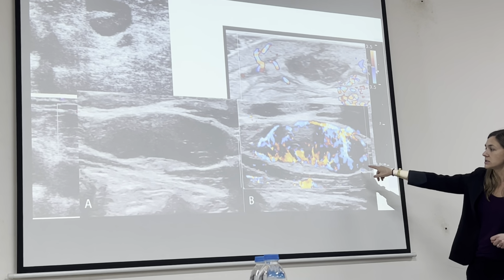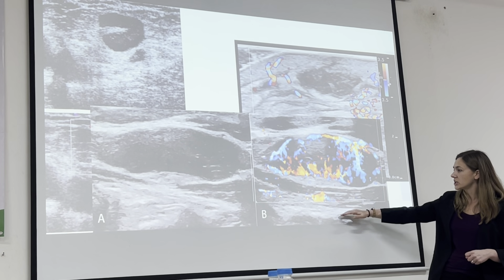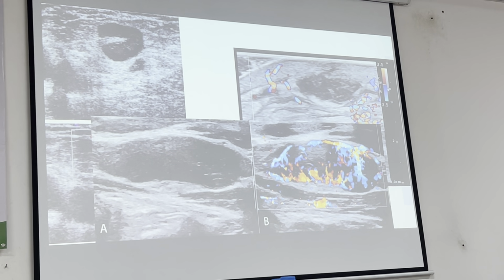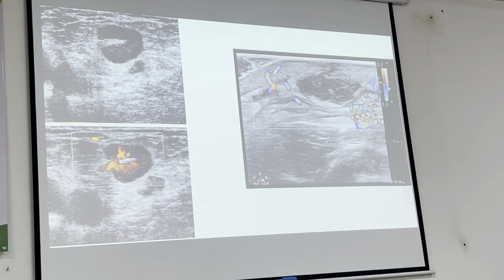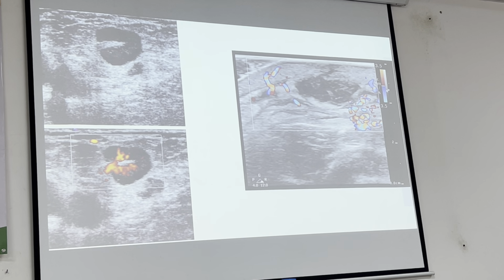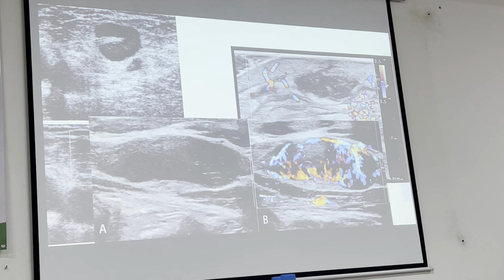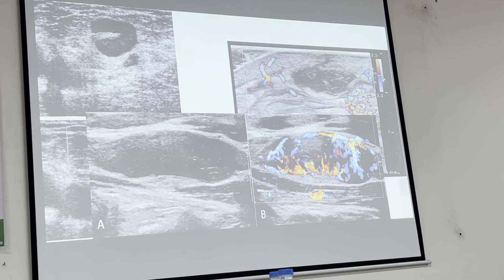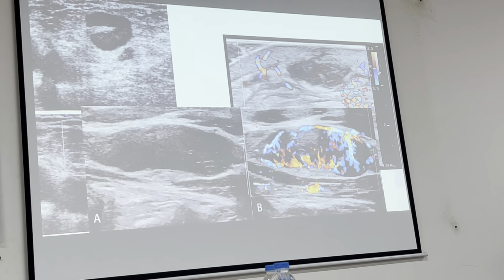Whereas in the lymph node, as you can see, you're not getting any of that posterior hyperechogenic shadowing there. So that can also be another clue that you're dealing with a lymph node instead of an abscess. Go back up with me so we can see a little bit more of the bright white posterior to the abscess on the right. And then we'll go here, and even though it may look on the left of the screen that there's a little bit of enhancement, when you fan through it, it goes away and it's not as bright as with an abscess, as you would see on a lymph node.